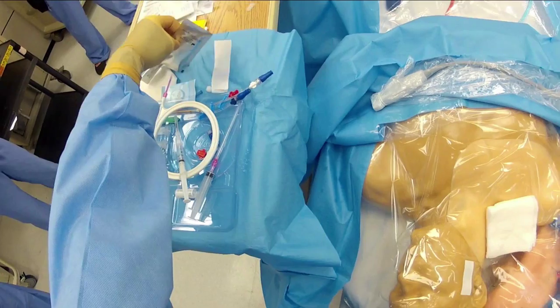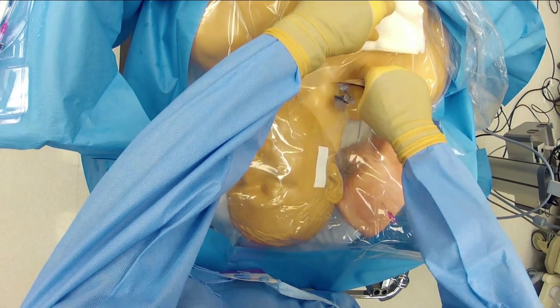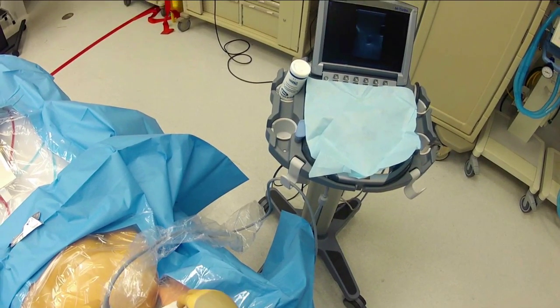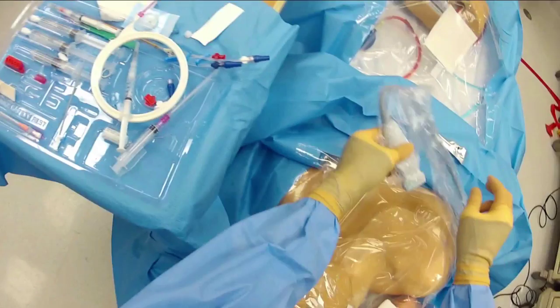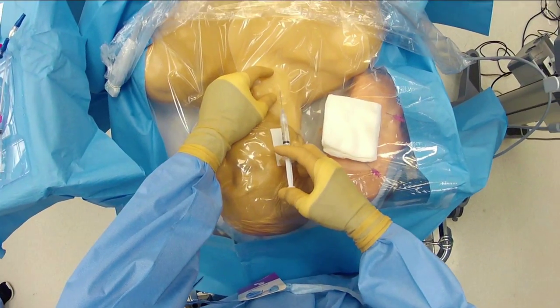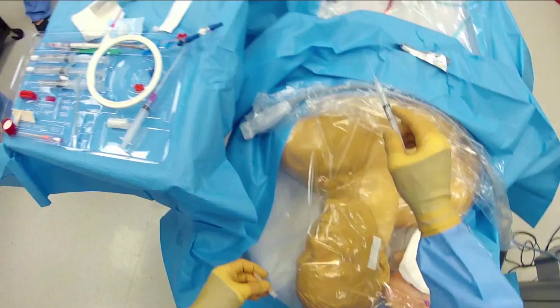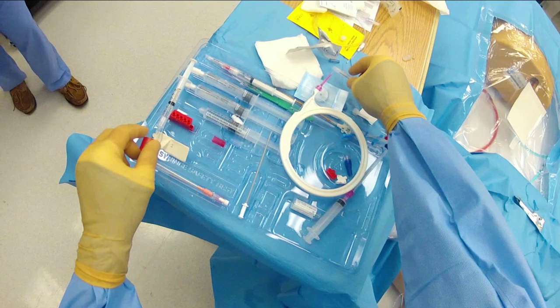We take some sterile gel and place it on the patient who has already been sterile draped. Just enough gel to visualize without getting too much in the way for the procedure. We look at the ultrasound screen to localize the vessel, capture an image, and then take the procedure lidocaine needle to inject the skin and subcutaneous tissues in the marked area. You can either mark or inject in real time under ultrasound guidance — whichever is your preference. Just make sure the area you're injecting with lidocaine is where you will place the introducer needle and that you're not off axis.